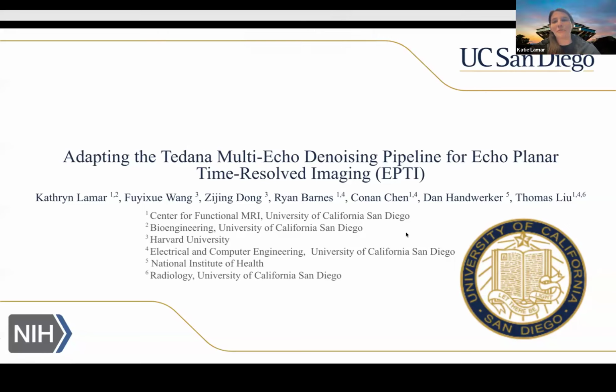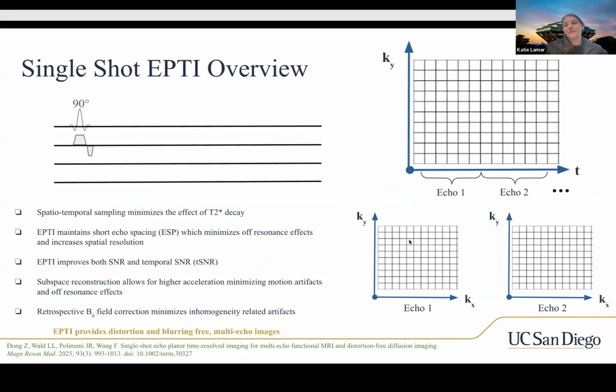All right. Hi, everyone. Can everyone hear me? Yeah, cool. So my name is Katie Lamar, and today I'll be covering some of the updates I've made to tedana to make it compatible with data acquired using echoplanar time-resolved imaging, or EPTI. I don't know if any of you have heard of what EPTI is, but basically it's a variant of EPI introduced in about 2019. It was designed to minimize the distortion and blurring artifacts that we see with EPI without sacrificing the speed.